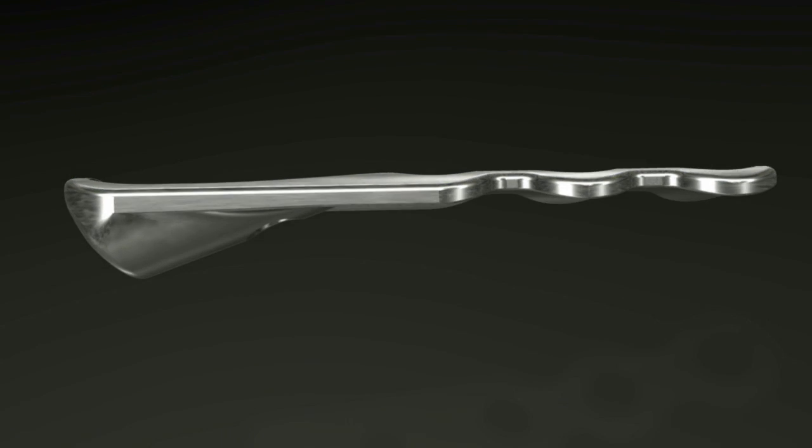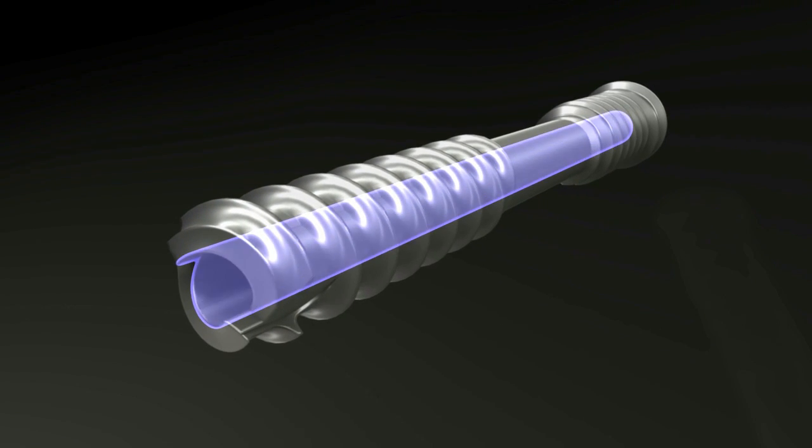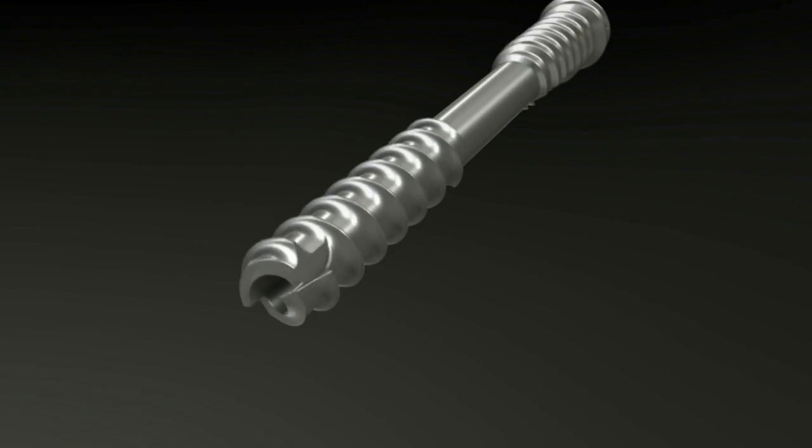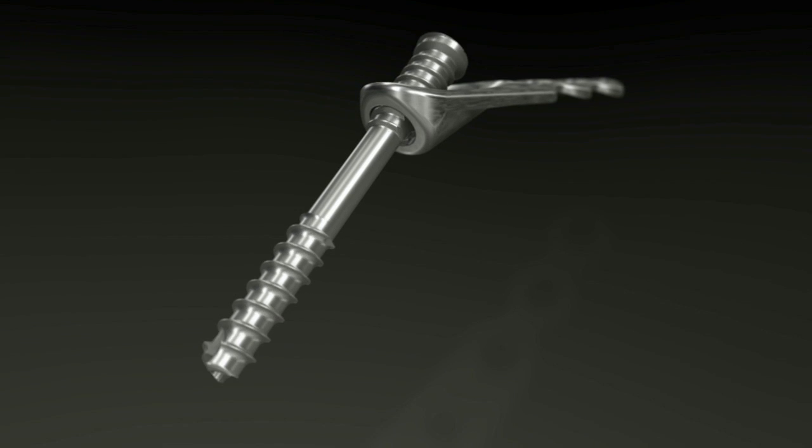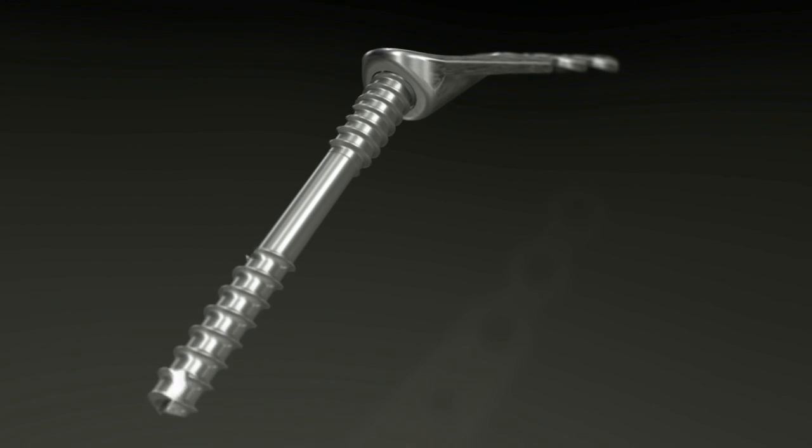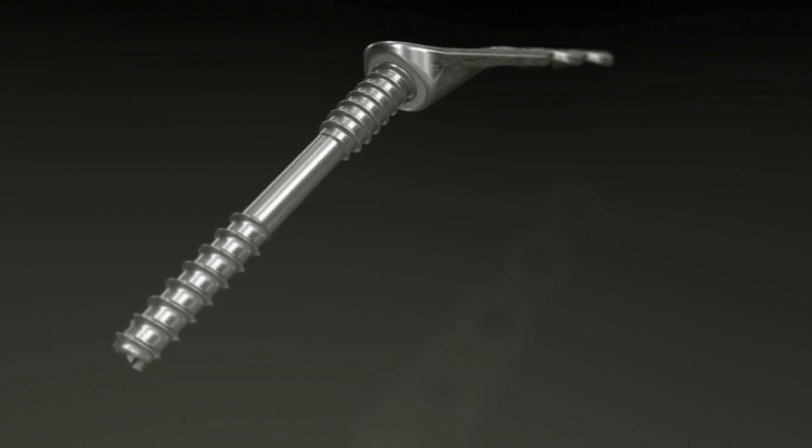The system includes the first cannulated compression screw with locking capabilities. The fusion screw can lock up to 18 degrees from center, allowing for fusion of the joint at a natural resting angle.